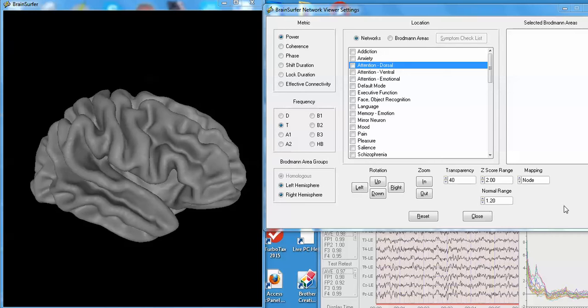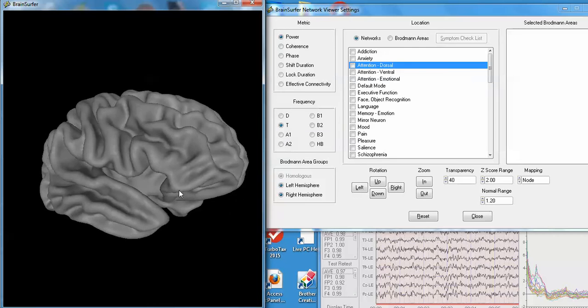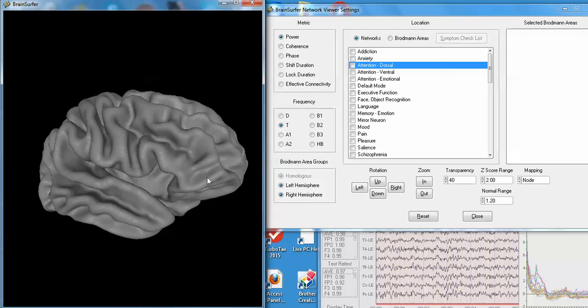One then clicks Analysis, Loretta, BrainSurfer Network Viewer. And when you do, this particular display will appear. This is a rendered brain in which there's a number of options to look at power, coherence, phase from different networks.